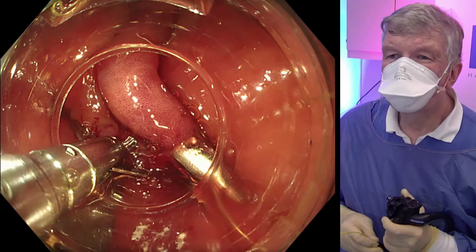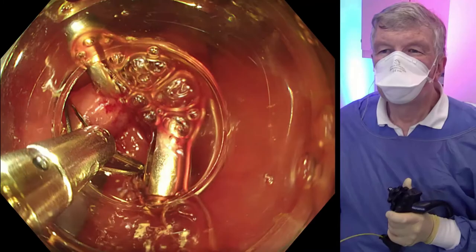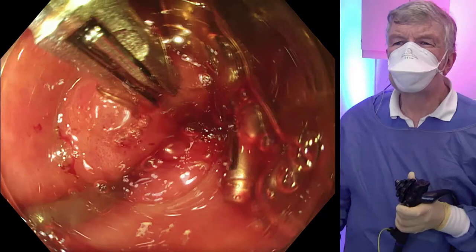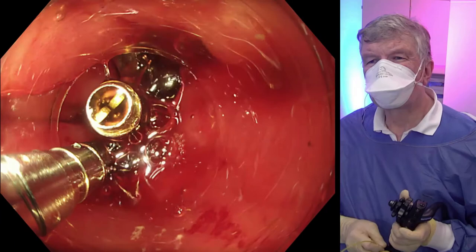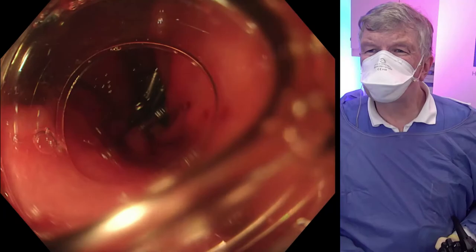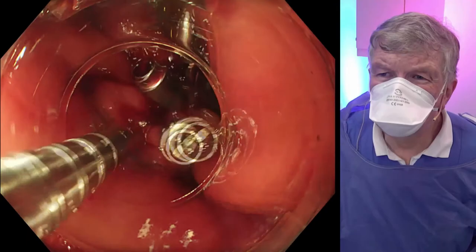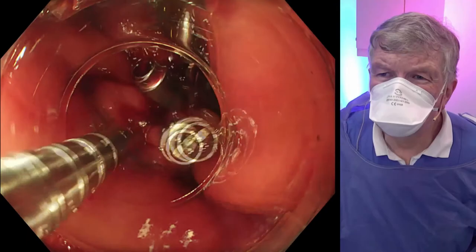Both margins are adapted, and we continue with further clips, which have to be large enough to grasp the two sides. We need a final clip to prevent reopening by gastric motility. This is the final clip at the proximal margin. The clip is closed slowly and fired. No complications after the procedure, and clinical follow-up is not yet long enough to assess effectiveness.